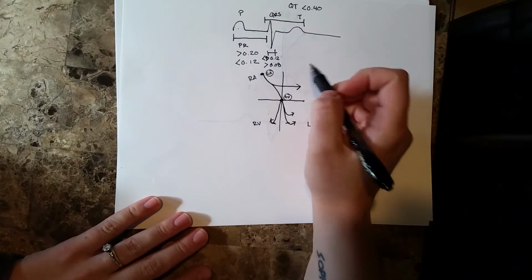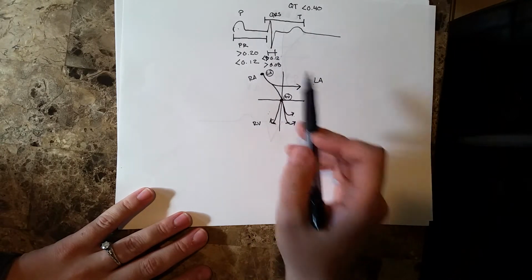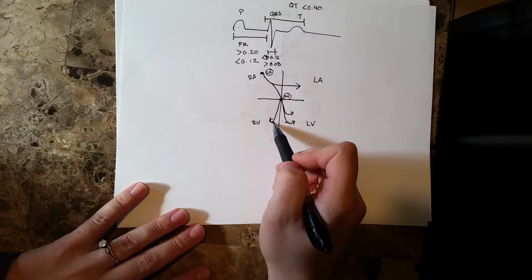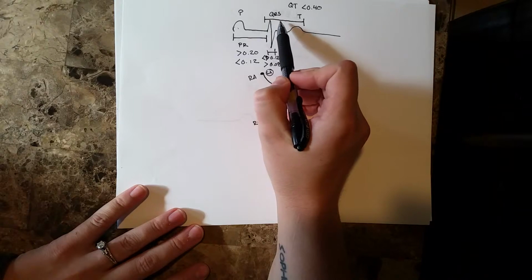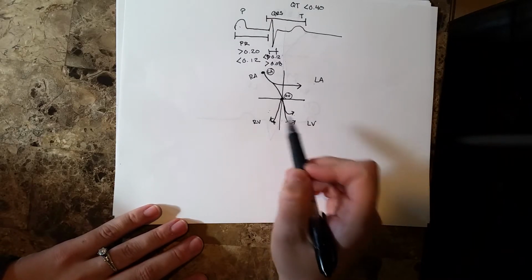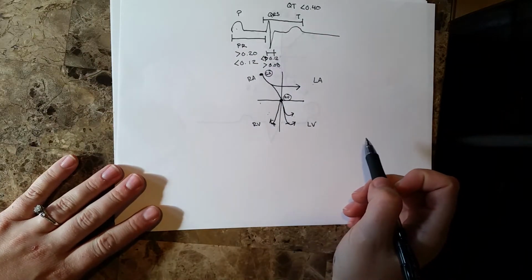So what causes the PR interval? This amount of time from the beginning of the P wave to the first deflection in the QRS is the amount of time it takes for the electricity to make its way from the sinoatrial node through the AV node and down here to where the electricity starts to come out of the bundle branches and cause the squeeze. The QRS interval, 0.12 to 0.08, is the amount of time that it takes for the electricity to move from the apex of the heart to capture all of the tissue in the ventricles so that the flow will start at the bottom and go back up to the top.